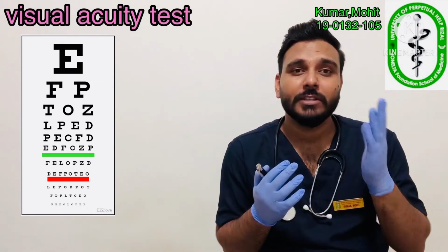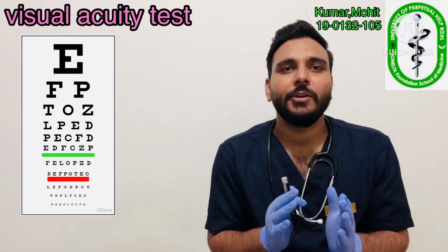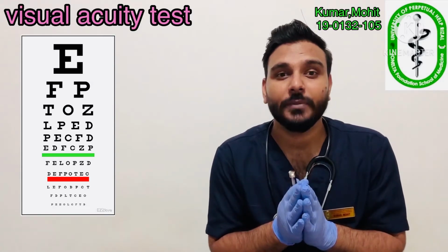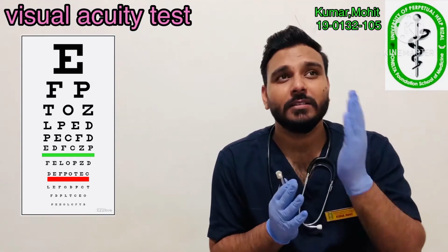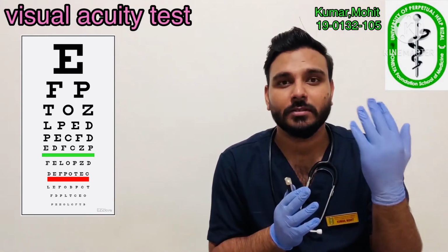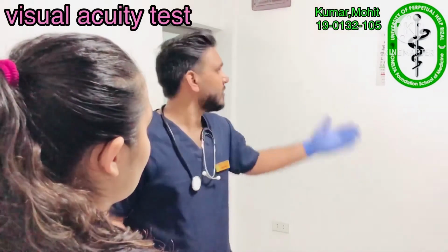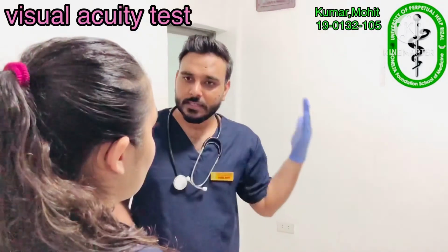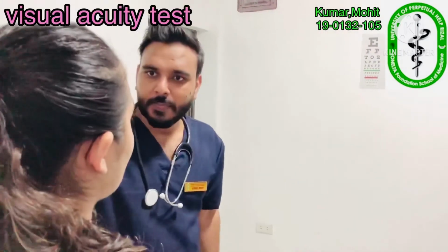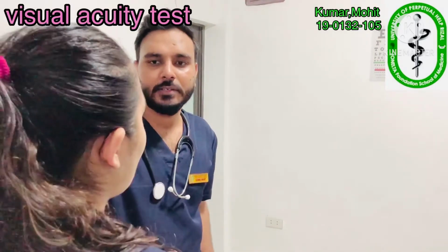For that we have a chart here which is known as the Snellen's eye chart. This visual acuity test is for the second cranial nerve, because we know the second cranial nerve is the optic nerve. The distance between the chart and the patient should be at least 20 feet. You have to read the letters as much as you can, going from up to down, and I'm going to cover one of her eyes. Okay, start reading now.